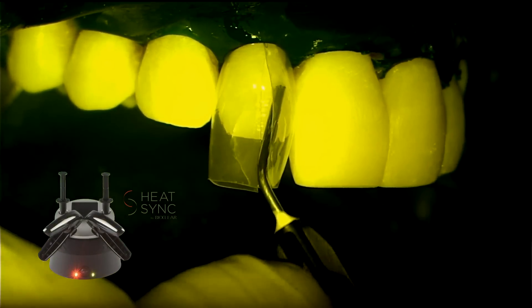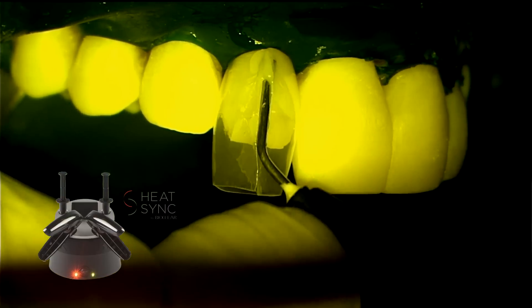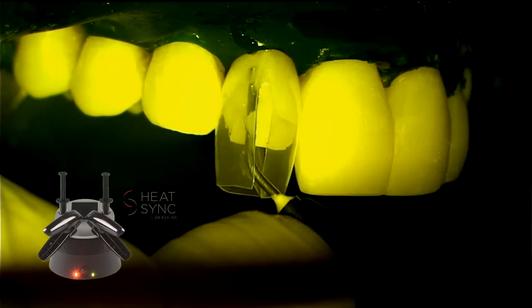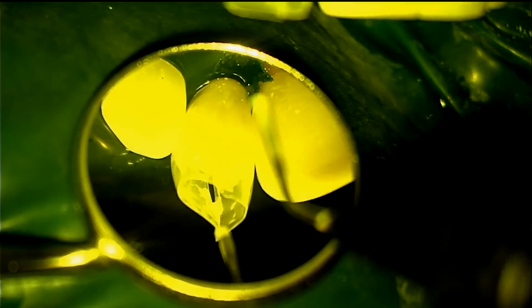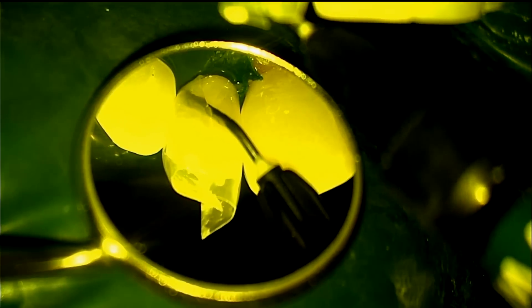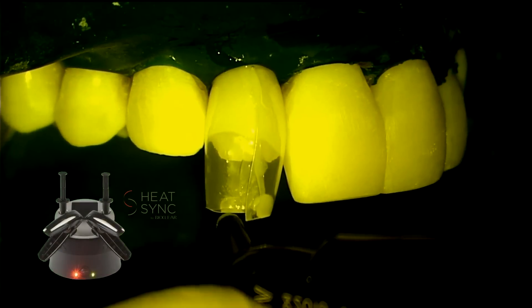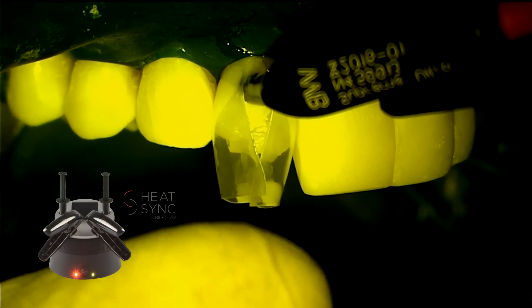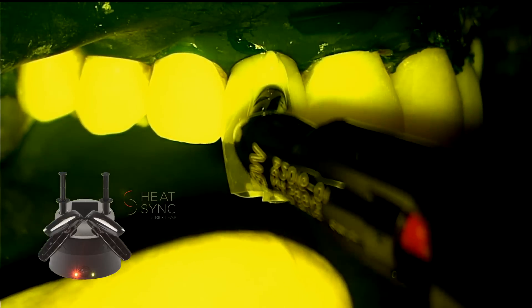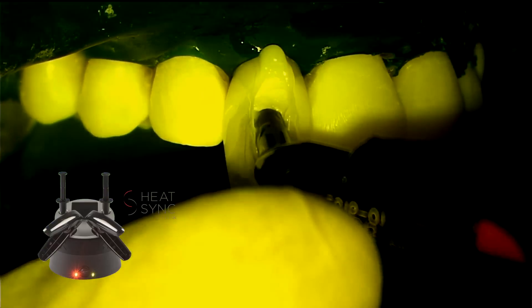Do not cure the adhesive yet. Go directly to injection of the warmed flowable composite. Injection of a warmed flowable composite is crucial in all gingival and interproximal areas. Next, the regular paste composite, which is also heated, is injected directly against the tooth and into the flowable composite to allow ideal flow. Start at the gingival, weaving mesiodistally, then toward the incisal, and then finally toward the palatal.